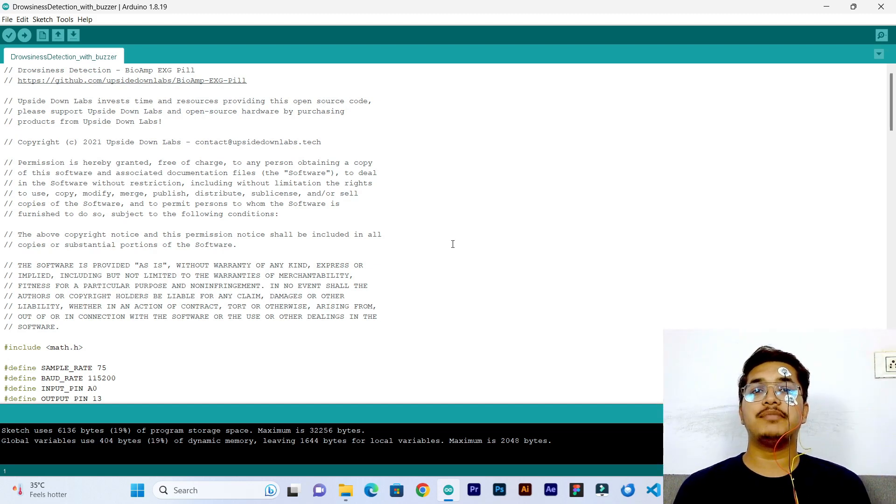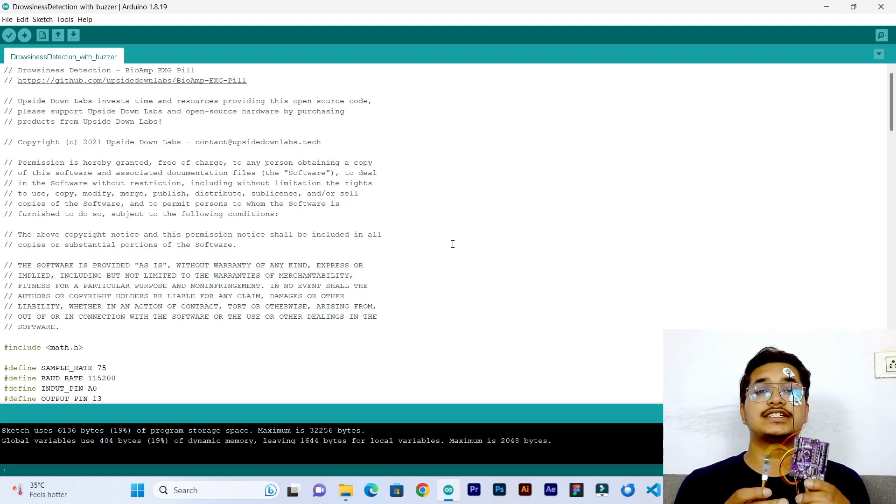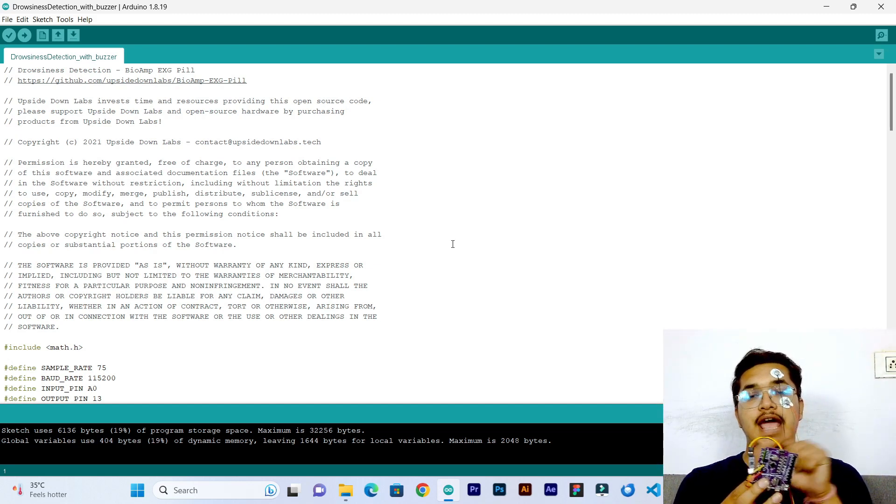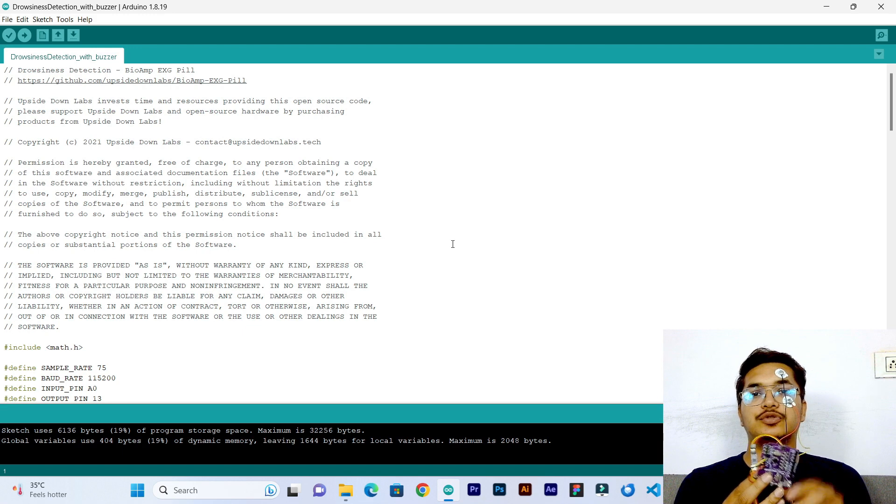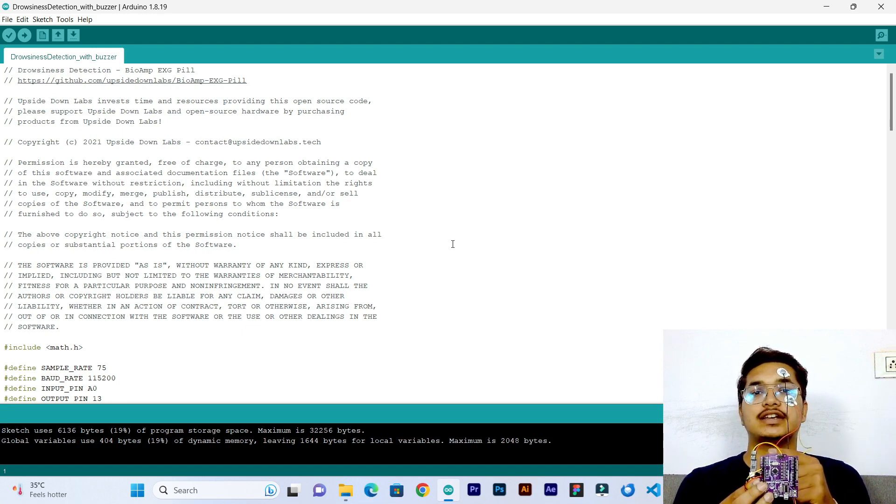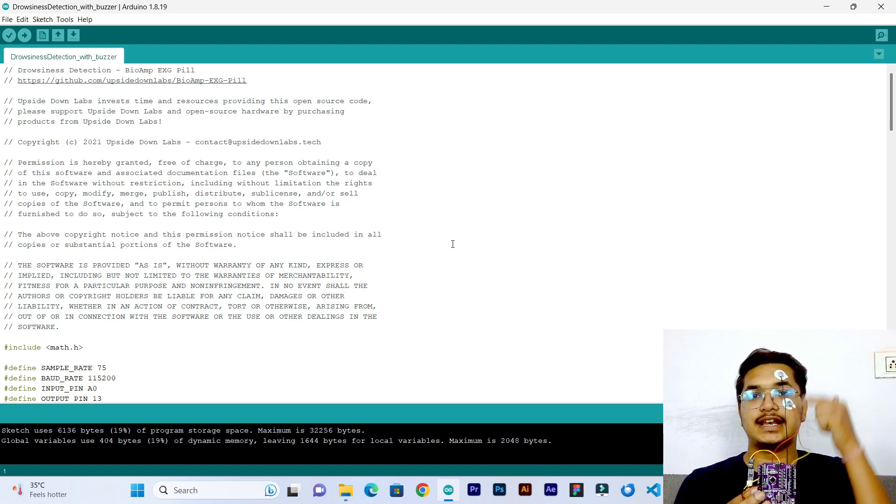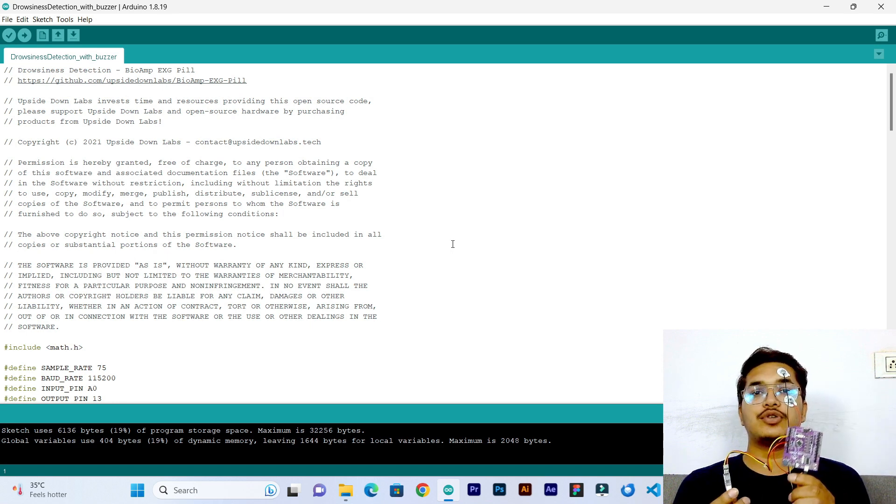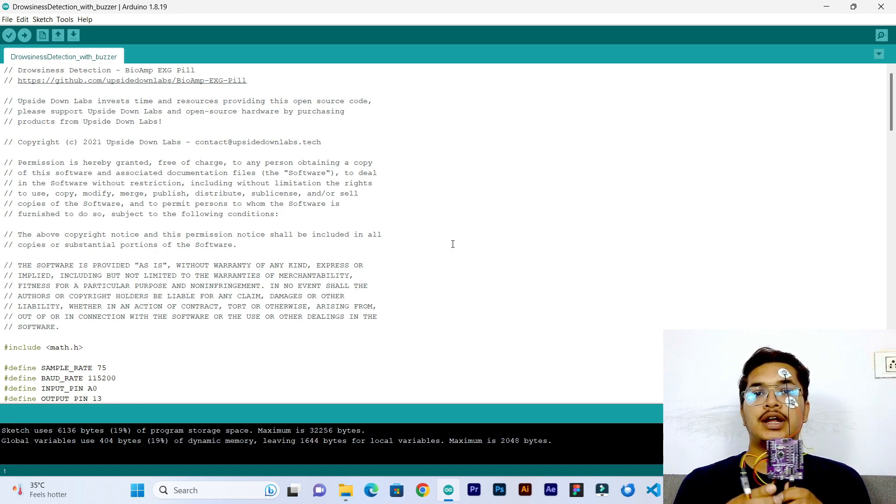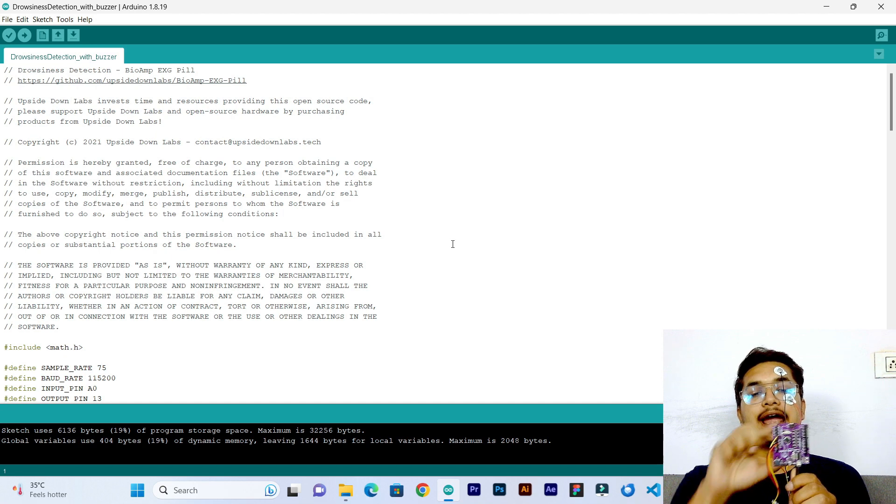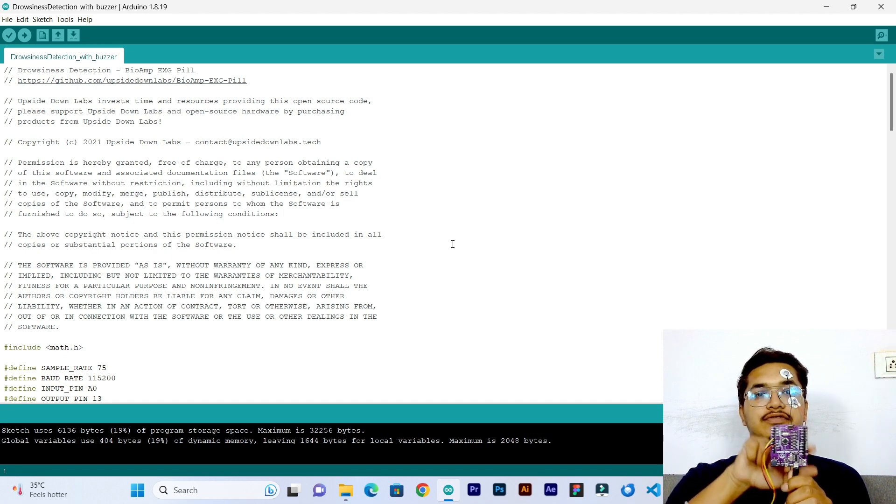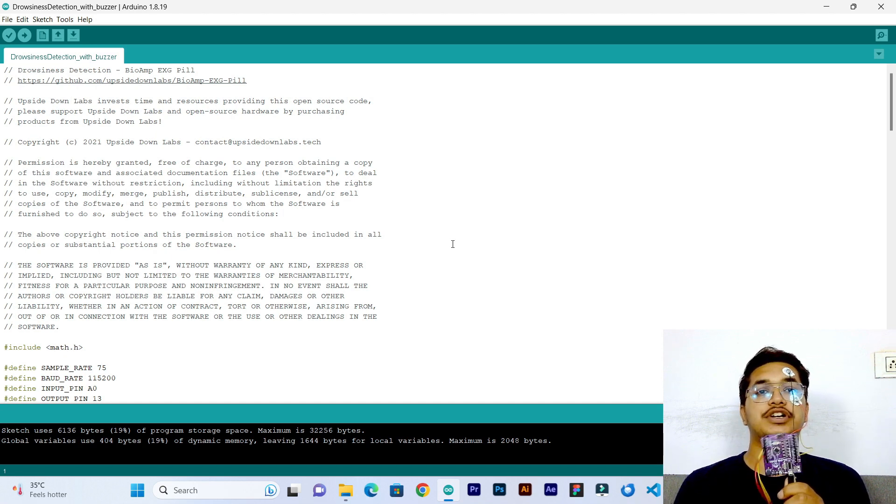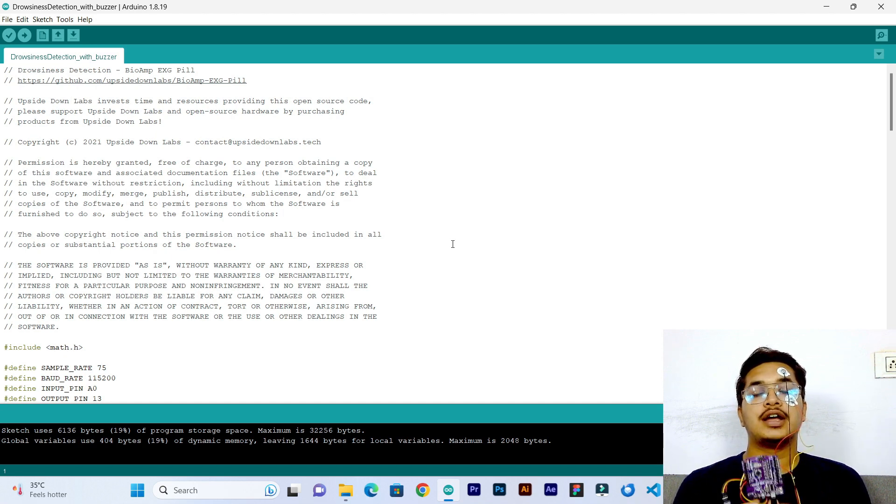Hi everyone, today we have made this drowsiness detector using BioAMP EXG Pill and Makeruno. BioAMP EXG Pill is recording the EOG signals from my eyes using these gel electrodes, and Makeruno is an Arduino compatible board that has onboard buzzer and LEDs which will be very useful for this particular project.